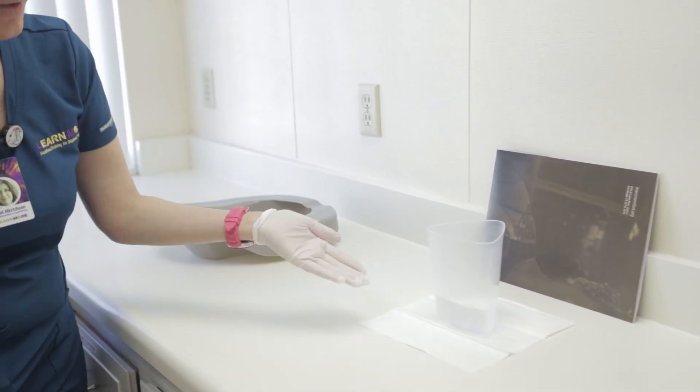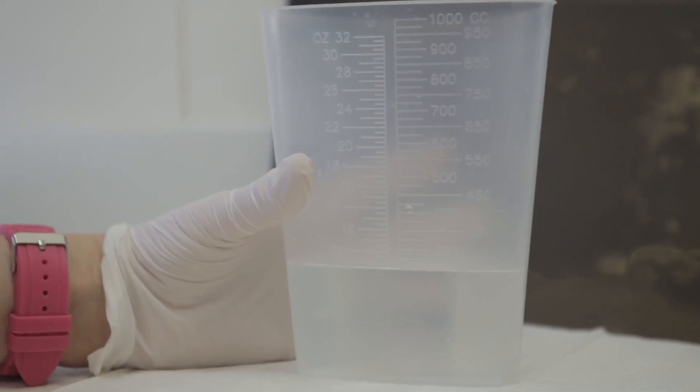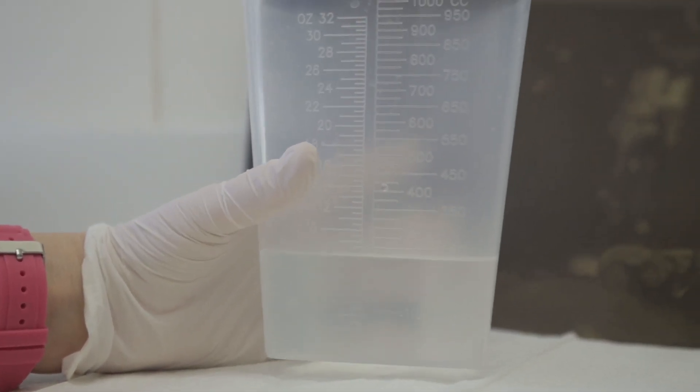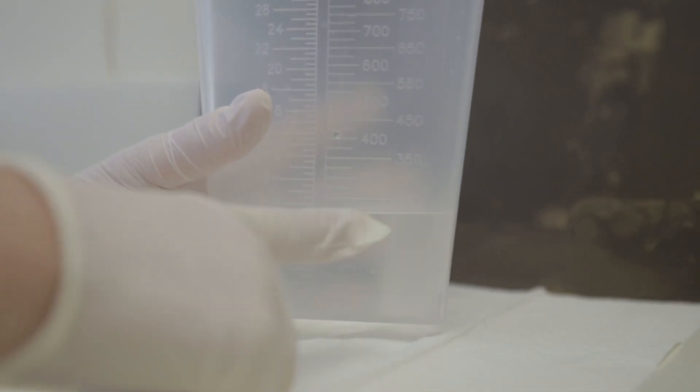Now, looking at eye level — you have to bend down to get to eye level — look at the graduated cylinder on the right side where it records the milliliters and CCs. Look at the number straight on; you will see it reads 250.